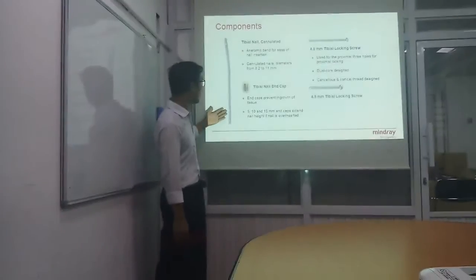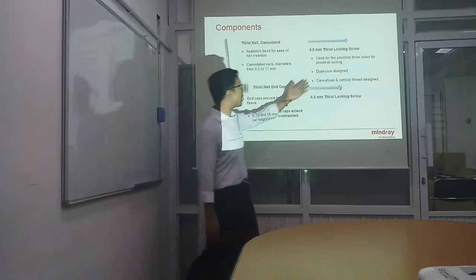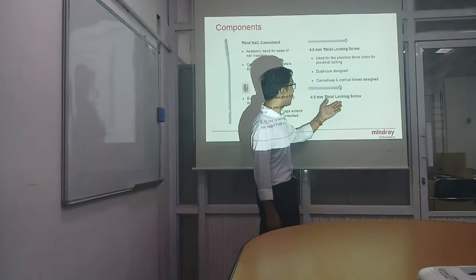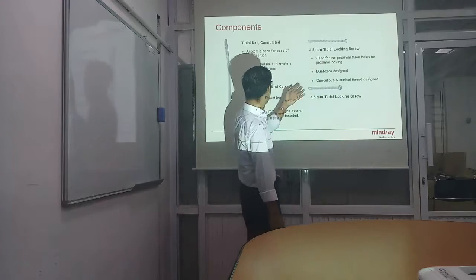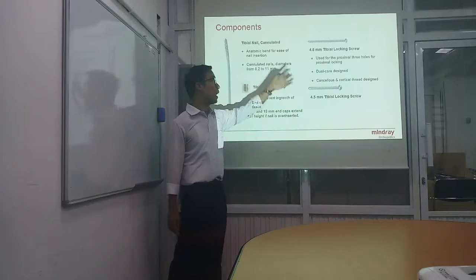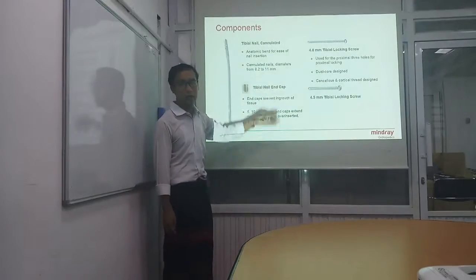This is the tibial nail, which is also used with the 4.8 tibia locking screw and the 4.5 tibia locking screw. It is also used with the tibial nail end cap. They are all titanium components.